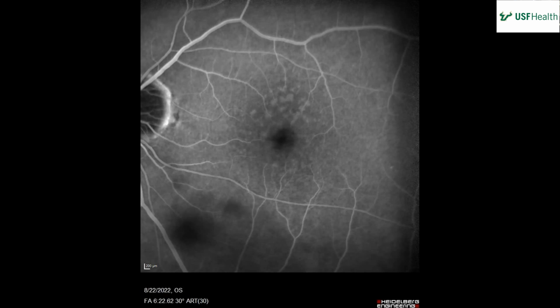That would be staining, unless on the OCT you see a dark area that's fluid, and that fills. Then that would be pooling. But if on the OCT you see a non-dark area, then it's staining. Okay, my definition of pooling, go ahead.